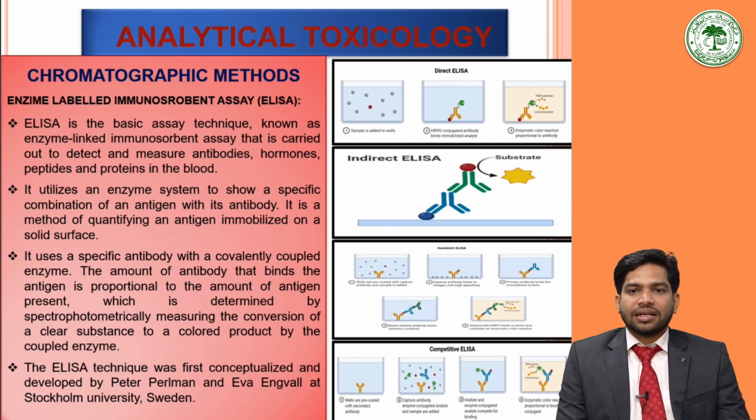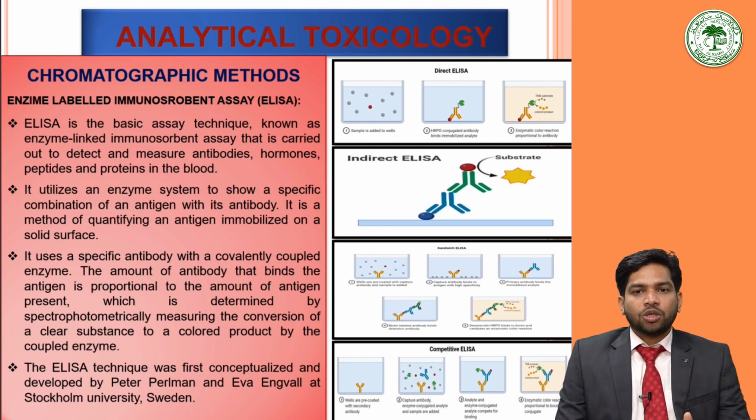So, the drug X binds with the enzyme-labeled antibody ABX and the unbound antibody is washed away. So, the bound labeled complex is measured, which is directly proportional to the amount of the drug X. So, this is the one-step non-competitive immunoassay. Then the two-step non-competitive immunoassay.